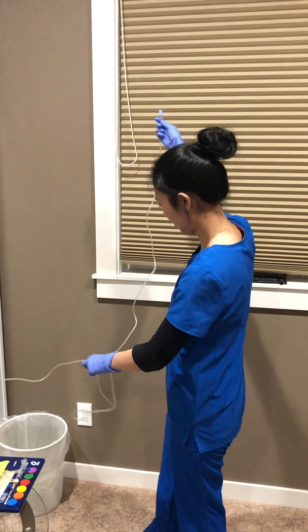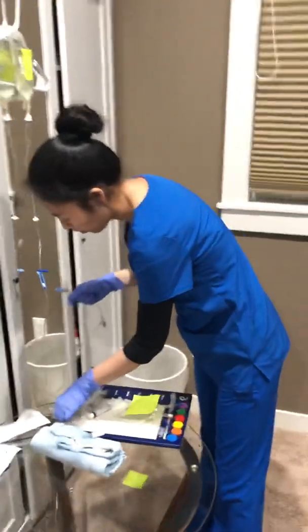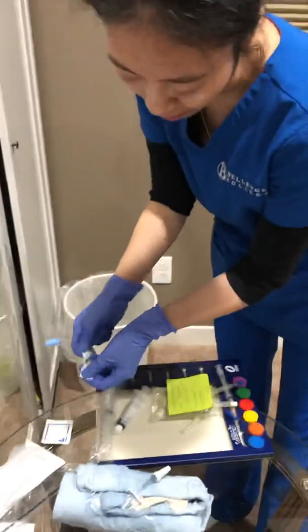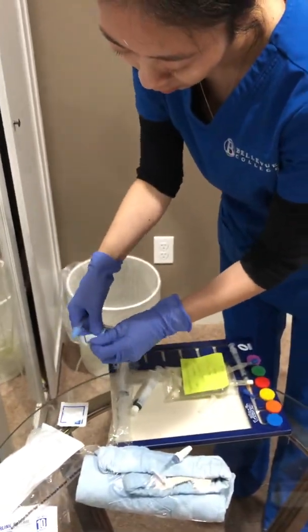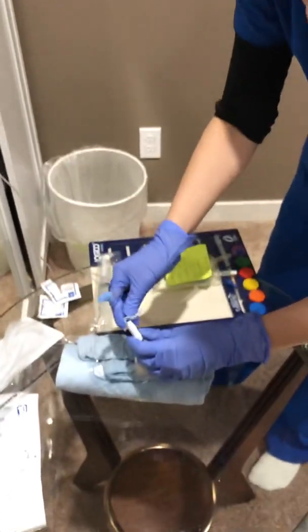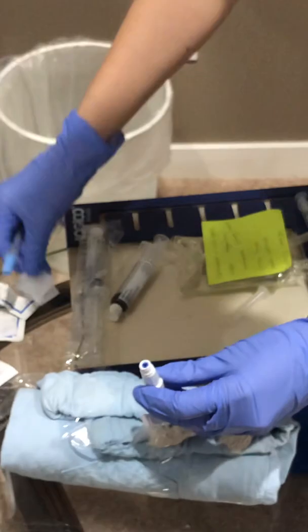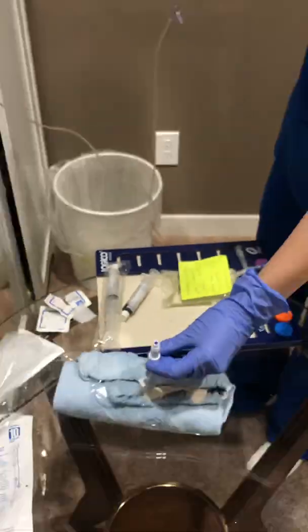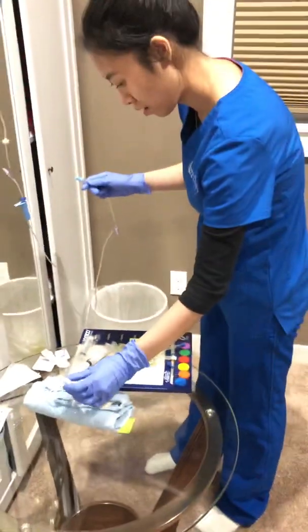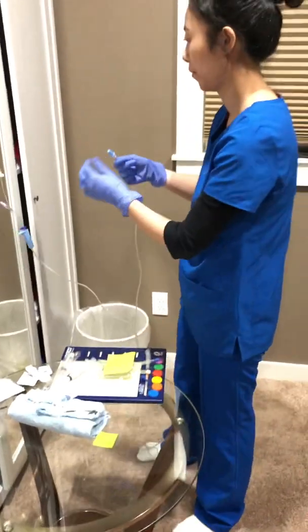Okay. Then now I'm going to use the alcohol wipe to wipe your port about 30 seconds. Okay, now it's 30 seconds and wait for it to dry. Okay.